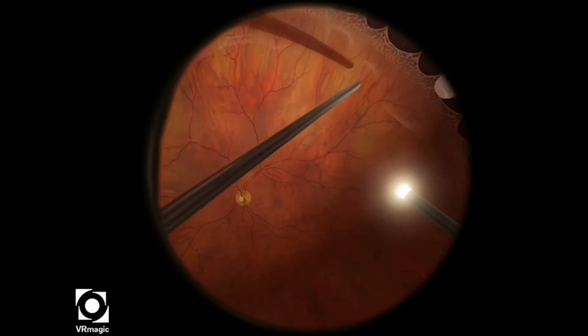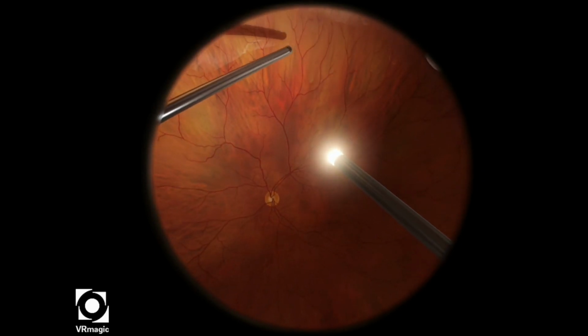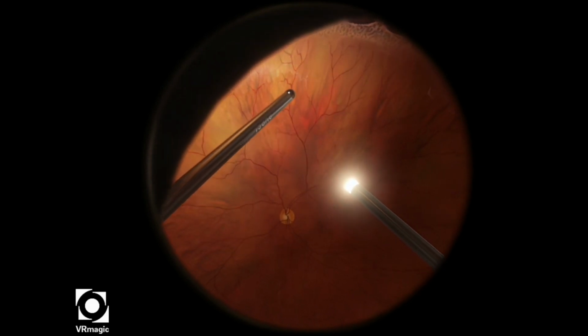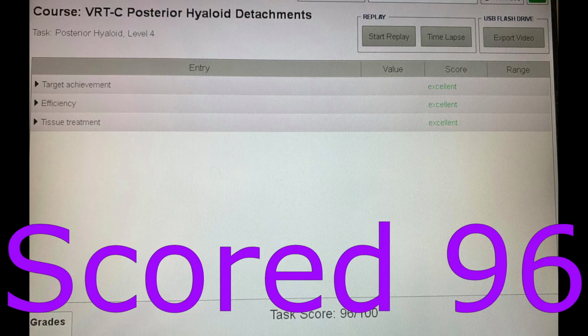So pulling a little bit more vitreous, and then I'm just trying to make it even on how much of the vitreous skirt I've left. So we scored 96 on that attempt.